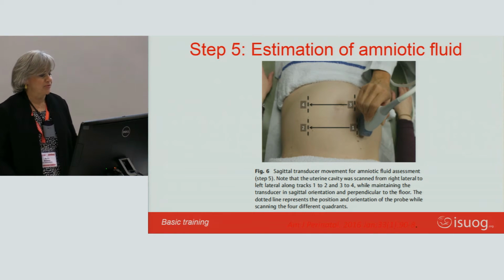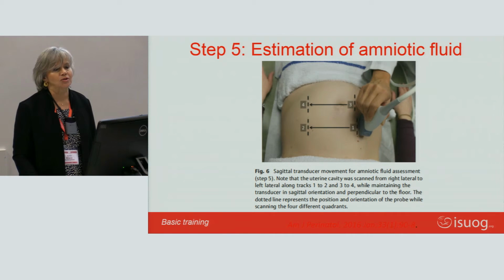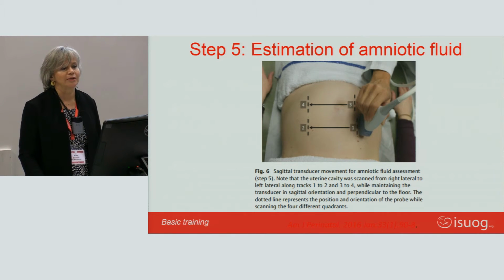Well, step number 5, estimation of the amniotic fluid. I think that you are all familiar with this concept of the amniotic fluid index.